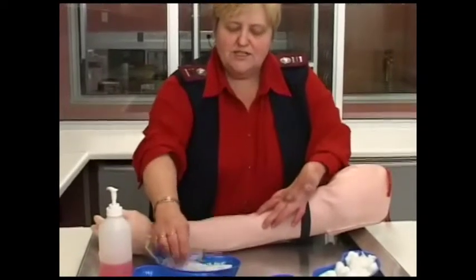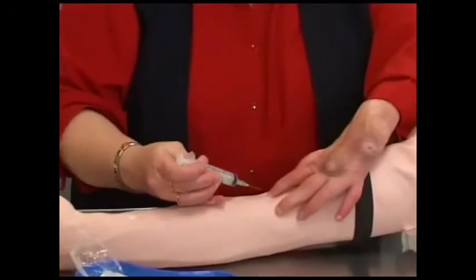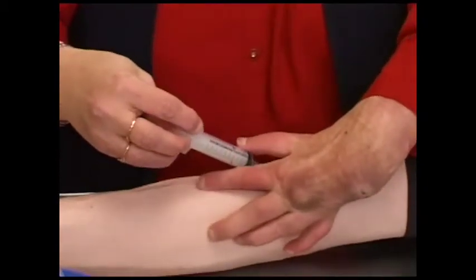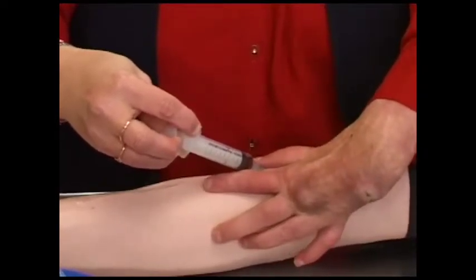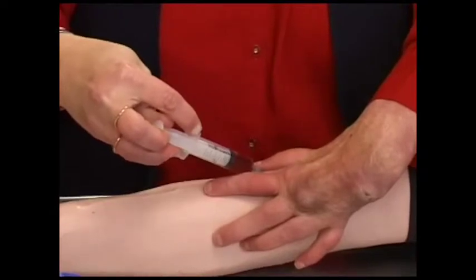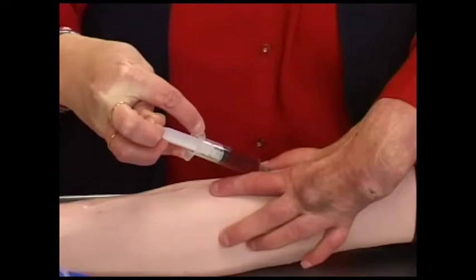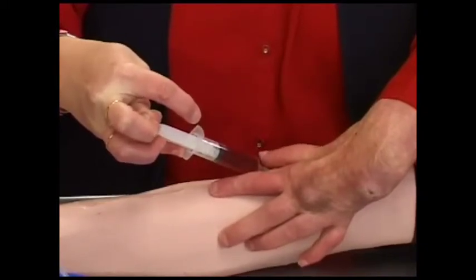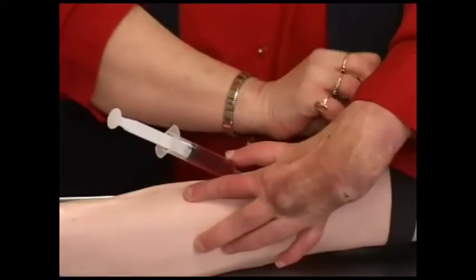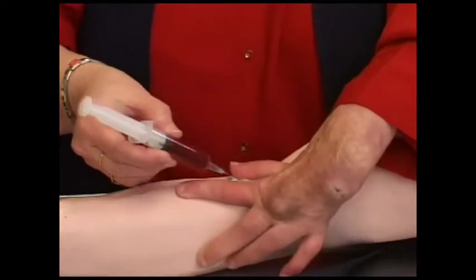You still need to stabilize your vein. Take your syringe bevel up, facing upwards, and insert it into the vein, then slowly pull back. Don't pull too hard because you don't want the blood to hemolyze. Slowly draw the blood, then loosen the tourniquet, take your piece of cotton wool, press down on it, and take out your needle.